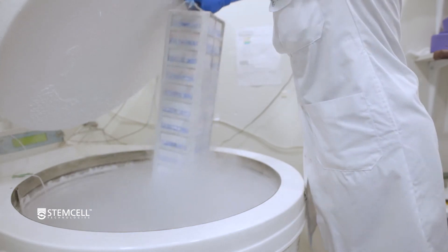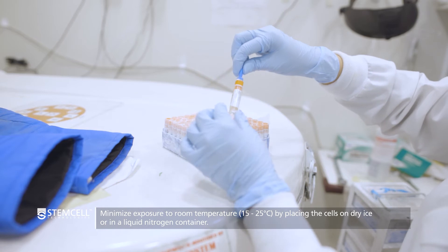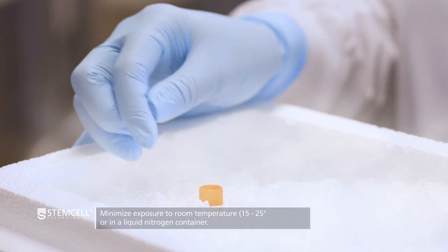When removing your frozen cells from storage, minimize exposure to room temperature. If you are not proceeding directly to thawing, place the cells on dry ice or in a liquid nitrogen container.